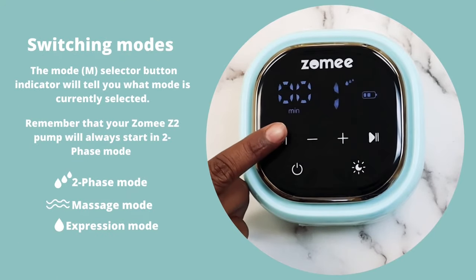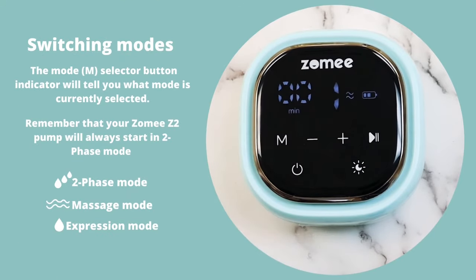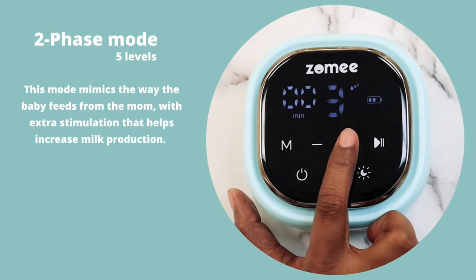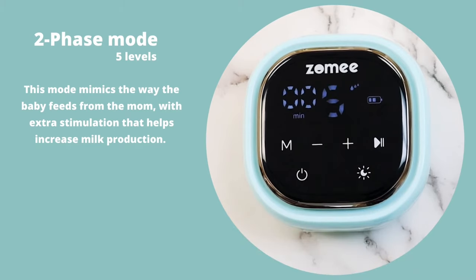Switching Modes. The Mode Selector button indicator will tell you what mode is currently selected. Your Z2 Pump will always start in two-phase mode — 5 levels. This mode mimics the way the baby feeds from the mom, with extra stimulation that helps increase milk production.